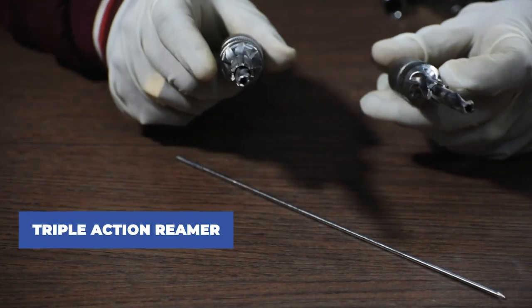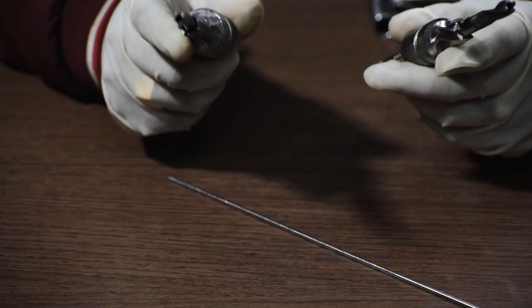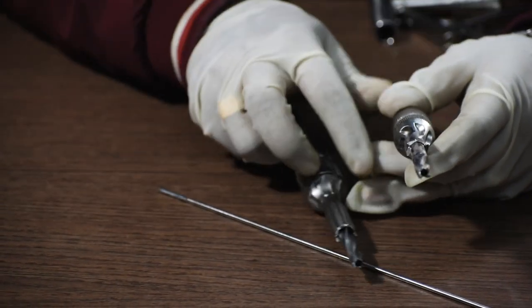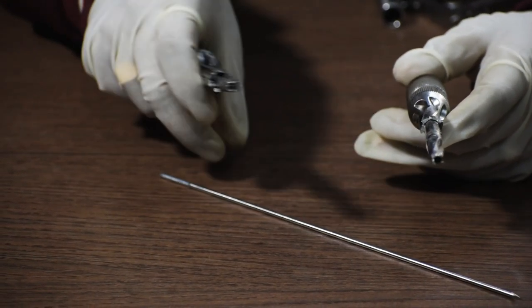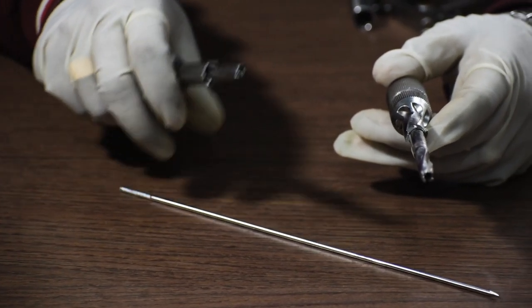After this we take a triple reamer, either a long barrel or a short barrel. If the measurement in the measuring scale comes above 80mm, we will use a long barrel triple reamer. And if it is below 80mm, we will use a short barrel.